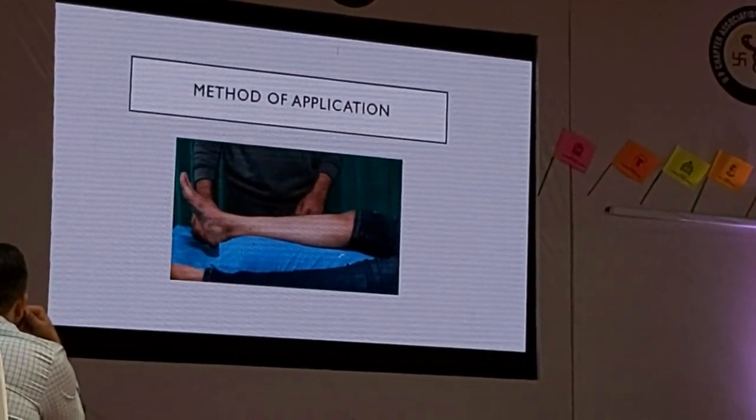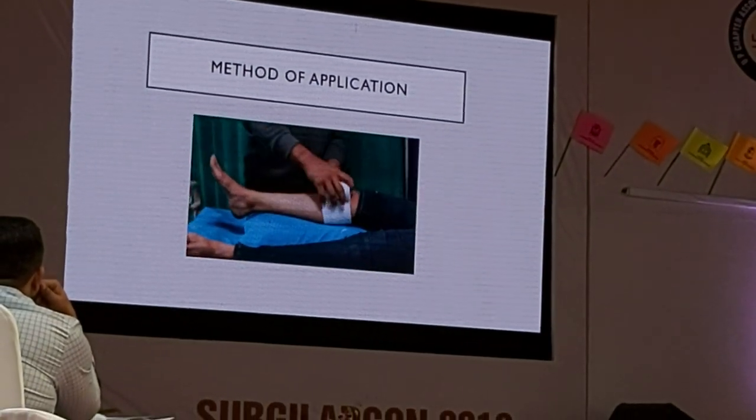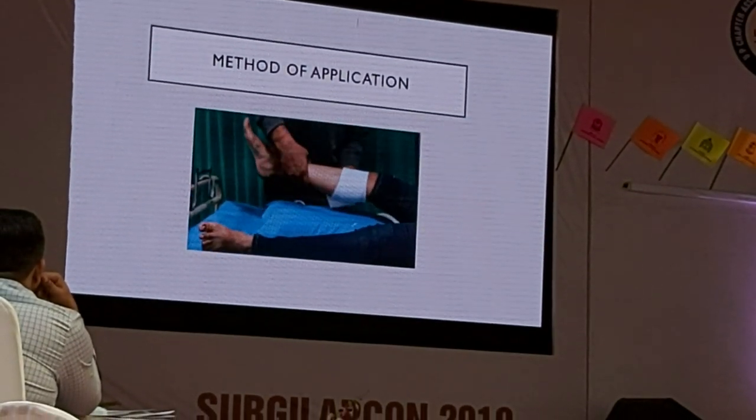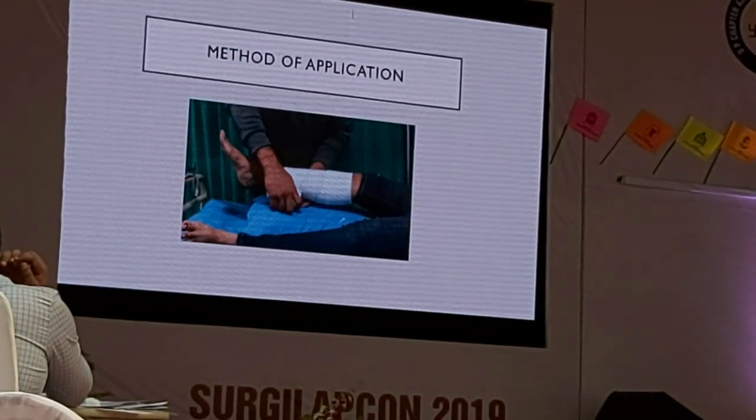We will start by covering the bony prominences with a soft roll to prevent any sort of pressure ulcers or sores. If you don't have a soft roll, you can also use a cotton roll instead.